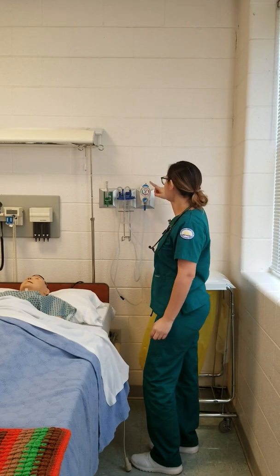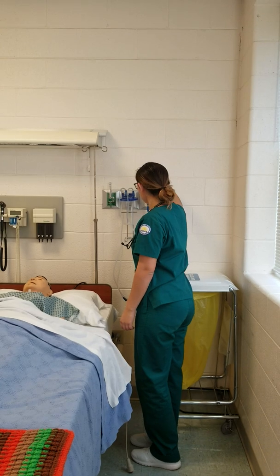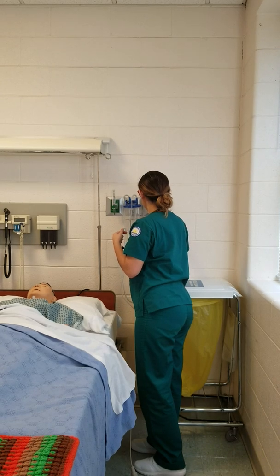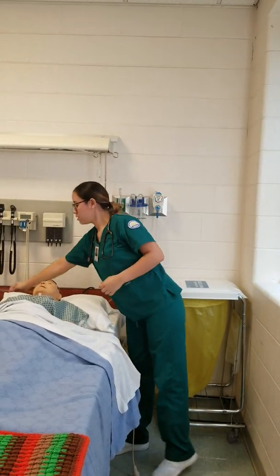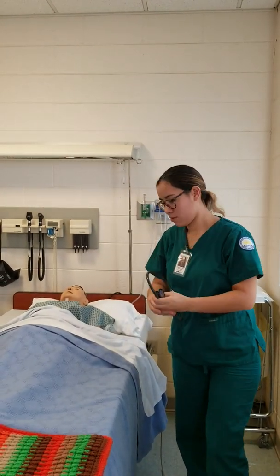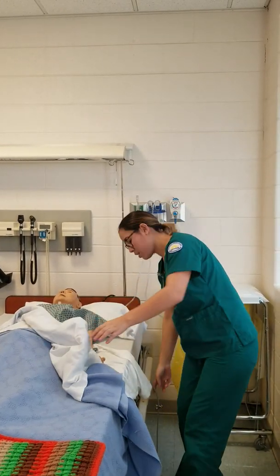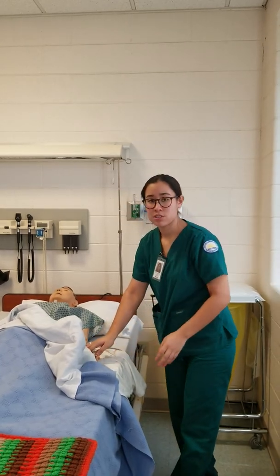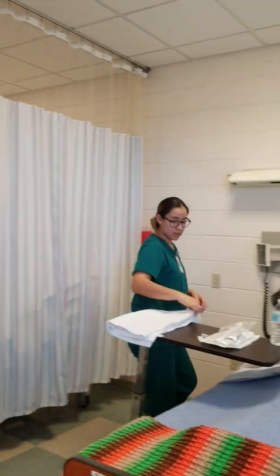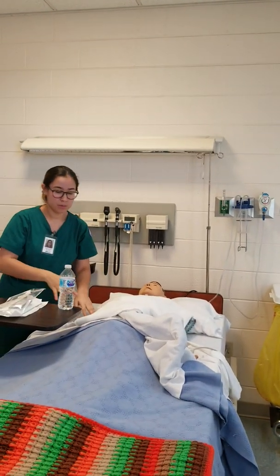Make sure the patient is set and then I would turn on suction. Suction is going to be turned on from 60 towards 120. I'm going to get my suction ready on the opposite side because that's the side I'll be working on. Aside from assessing his breath sounds, I'm also going to be putting a pulse ox on his finger and checking his oxygen level.